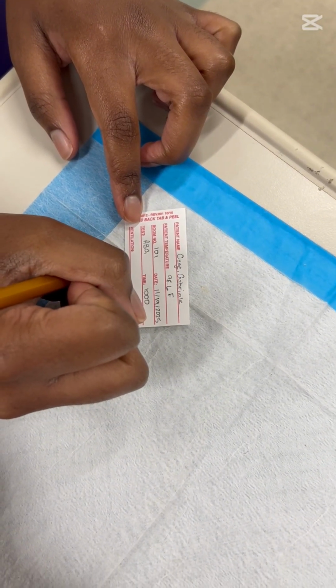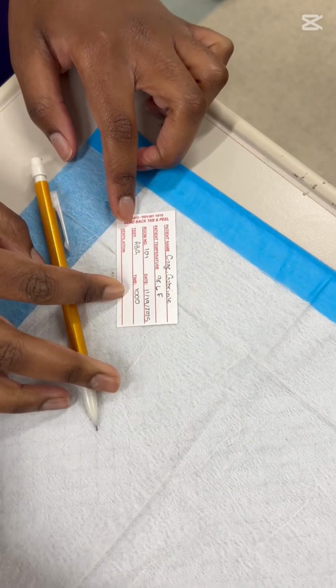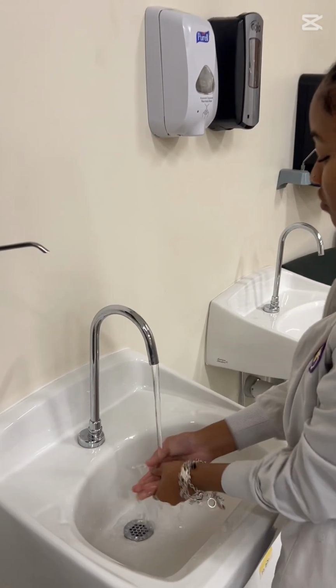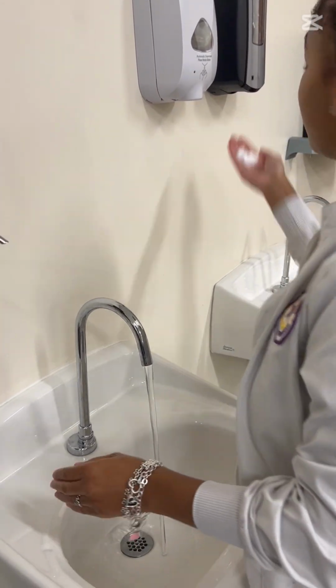You are going to place the needle into the sharps container and perform one more round of hand hygiene. And that will conclude our Grand Rounds nursing skill, which was an arterial blood gas draw.